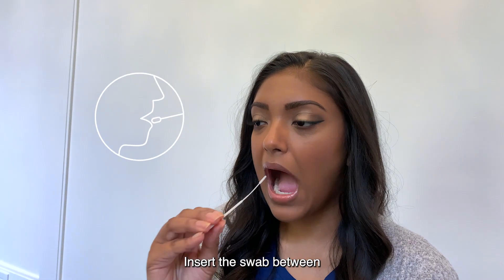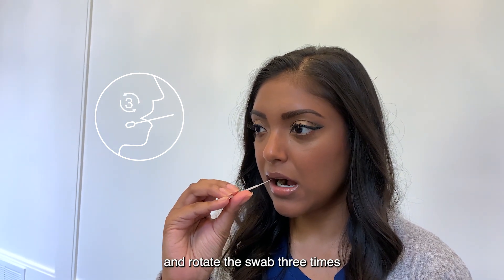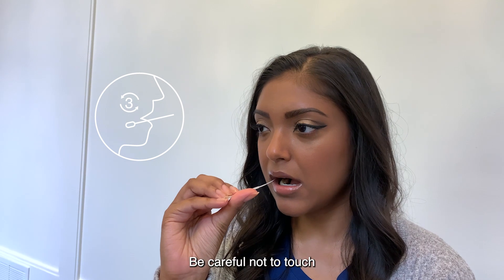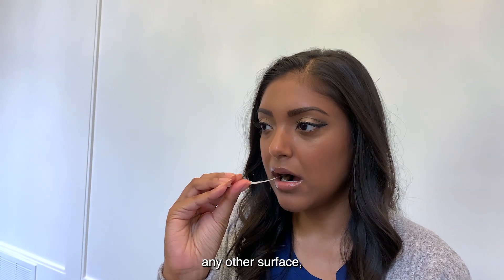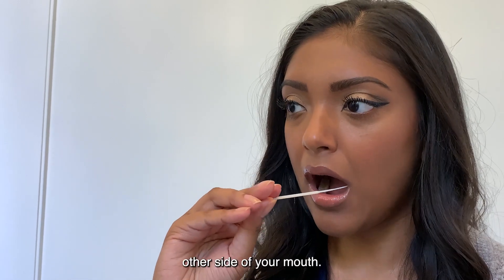Insert the swab between your cheek and lower gums on the side of your mouth and rotate the swab three times to ensure the swab is moistened. Be careful not to touch any other surface which could contaminate the sample. Then repeat on the other side of your mouth.